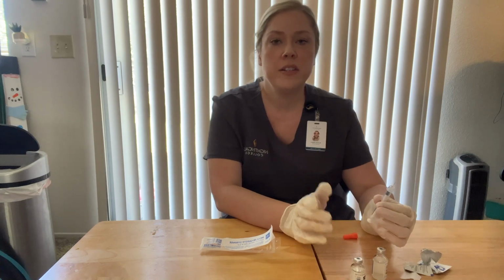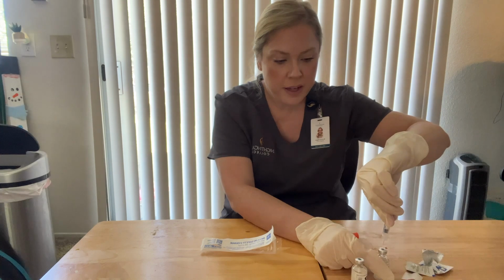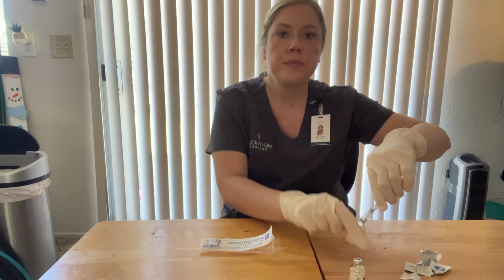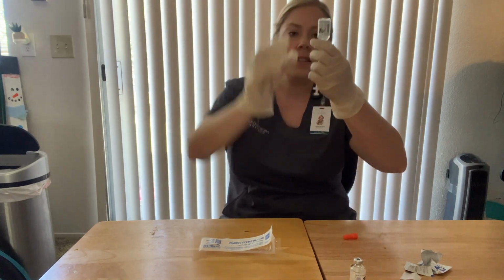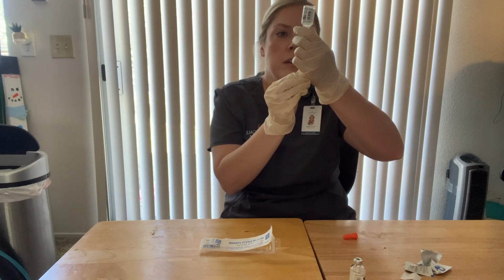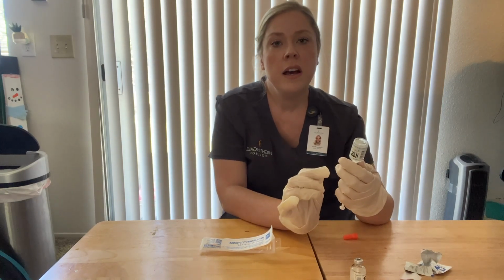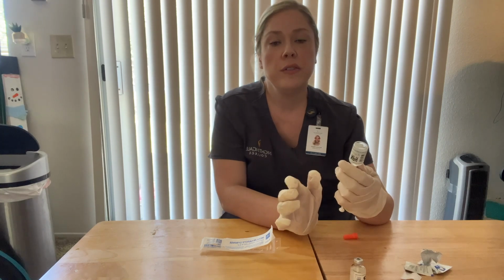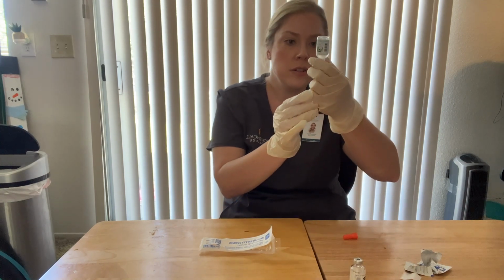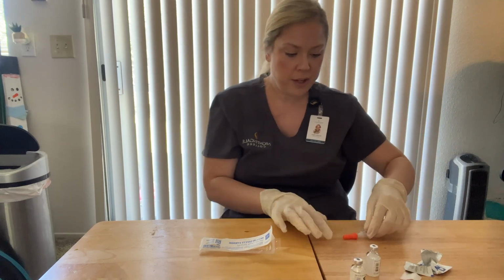And I did. And then I would check this combined dosage against the MAR again. Then I would want to place that needle back into the NPH vial and pull that 8 NPH. Okay. I want to make sure that we do not overdraw on this one. If we do, then we would have to start all over again. And everything looks good. Pull that out. We want to carefully recap.